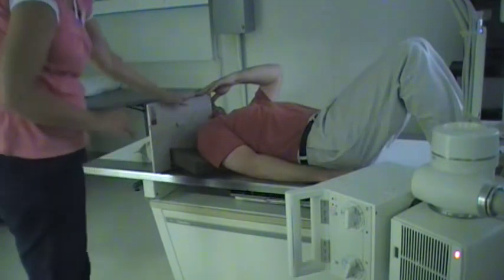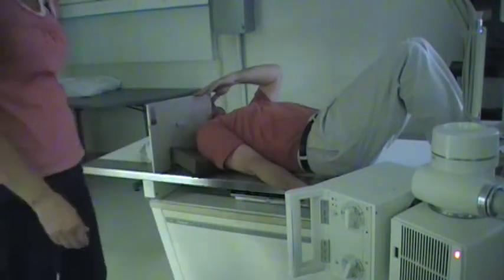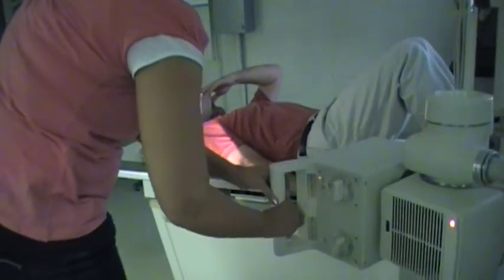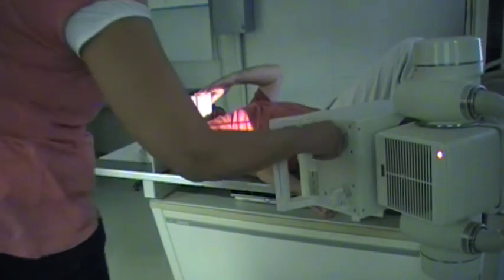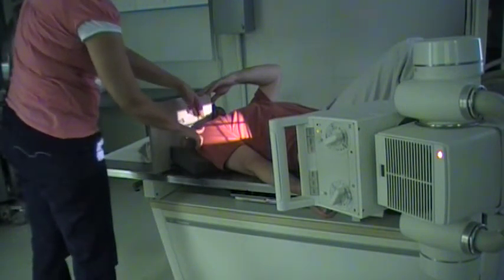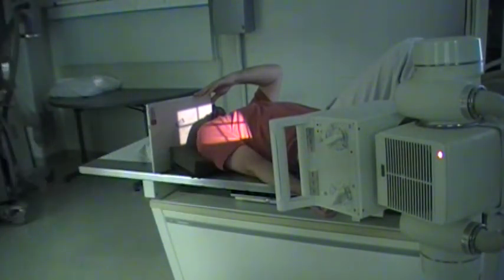We'll use the same setup with the cassette up here, but this time the arm is not pulled out. Turn the arm so that the hand is supinated. This is a tangential method, so we'll be skimming the upper border. You can have a slight tube angle of about 15 degrees down, and we're going to skim the very top edge. That groove is going to be right in between the greater tubercle and the lesser tubercle, cutting through right in this area. This is the method you would use if you're wanting to evaluate the groove in between the two tubercles.